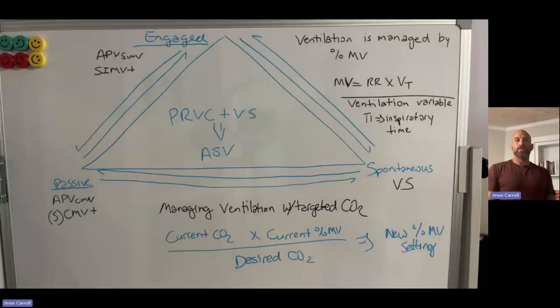All right, Jesse Carroll here, ready to do another deep dive into something known as closed loop ventilation. There are a couple different forms of closed loop ventilation, but today we're going to go over the specifics behind adaptive support ventilation, otherwise known as ASV.